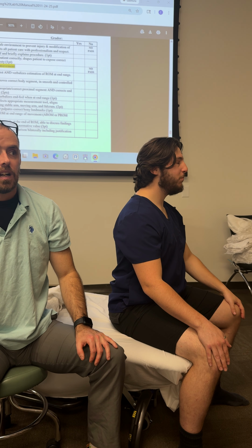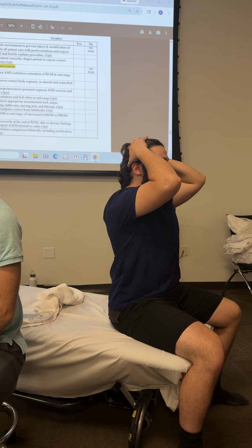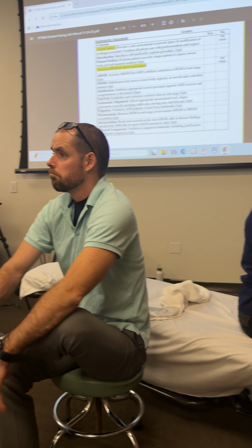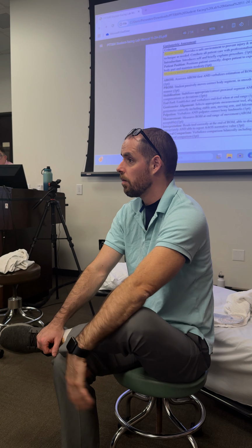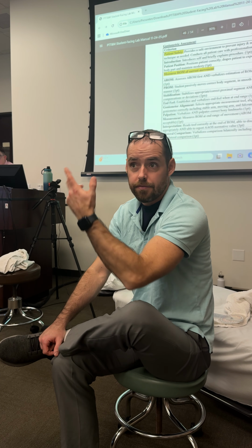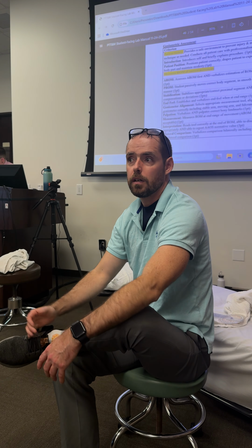Okay. Any more questions? Thinking in the future, say a patient has a head wrap or something, would you just ask them to poke their ear? That would be a good way to do it, because again, I don't want to be the one poking their ear, especially if there's something going on there. But yeah, if they had some sort of head trauma, have a wrap, I still need to be able to measure that. So yeah, I would just have them point. Great question.